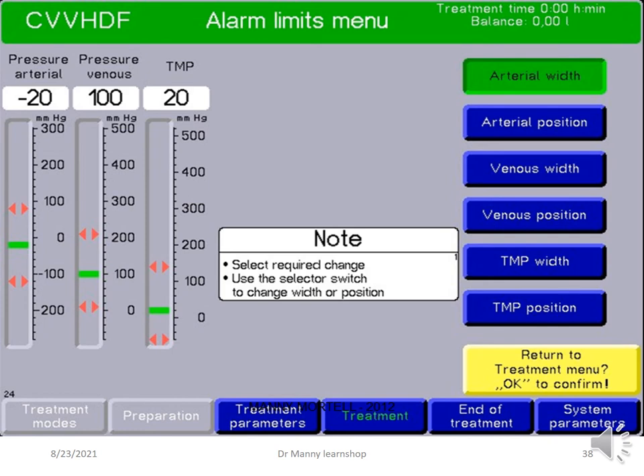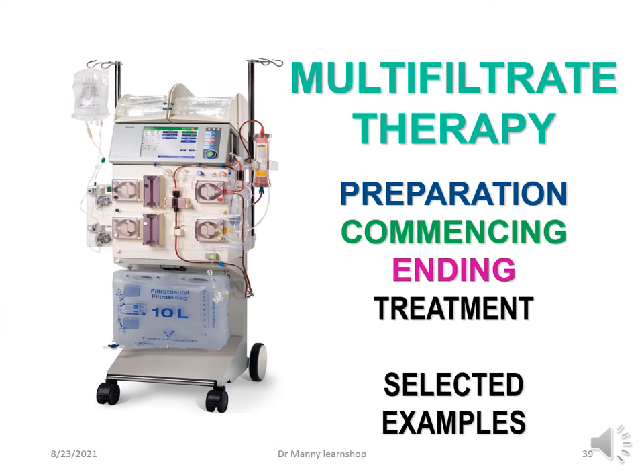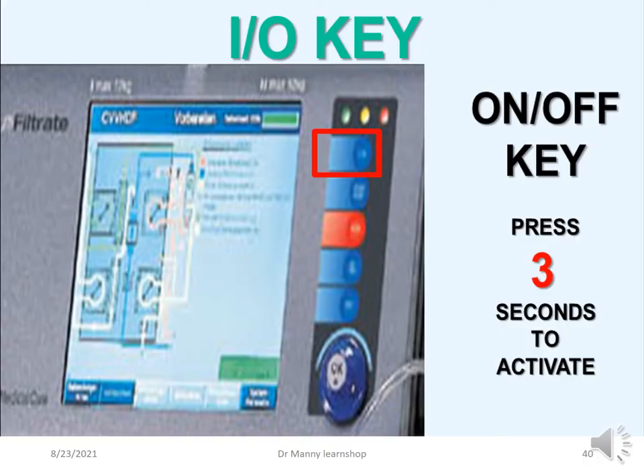Alarm limits can be adjusted: you can select the required change using the selector switch to change the width and position, decreasing or increasing the alarm limit range. To turn the machine on, press the on-off key for three seconds to activate it — the key is located at the top under the status lights.